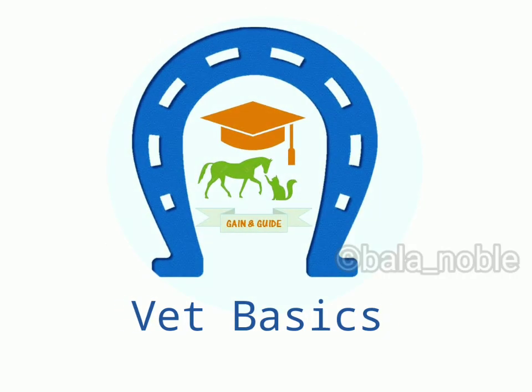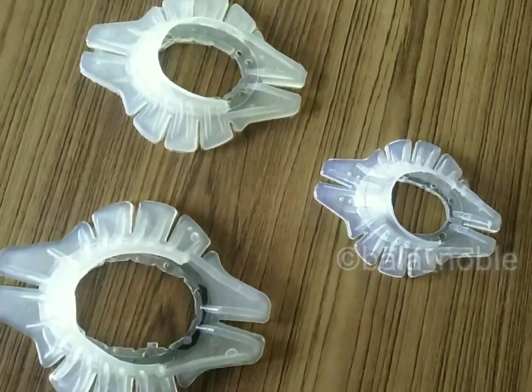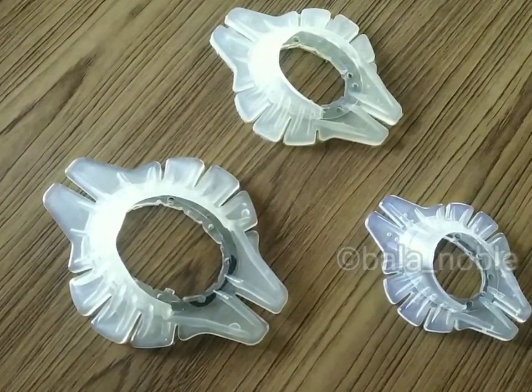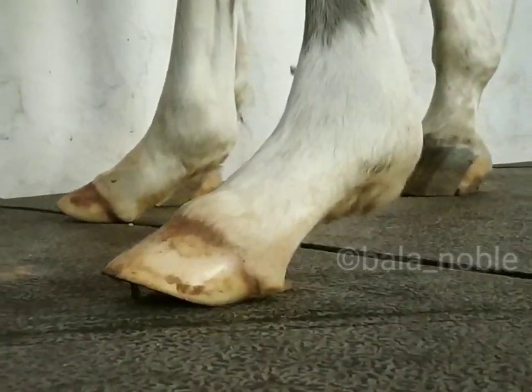Hi, welcome to vet basics. Today I will show you how to apply extension shoes in young foal. This is commonly used in mediolateral deformities or flaccid tendon cases. Now I am going to apply in a foal which has digital hyperextension or flaccid tendon.